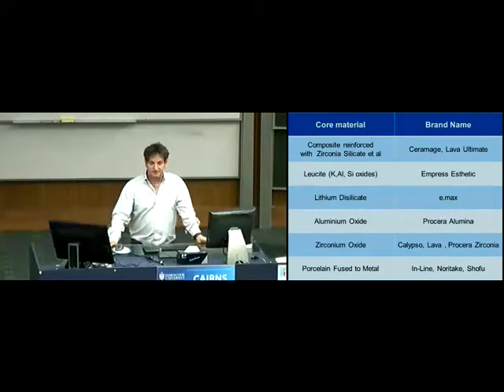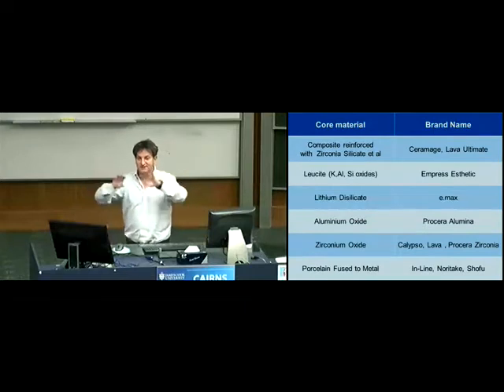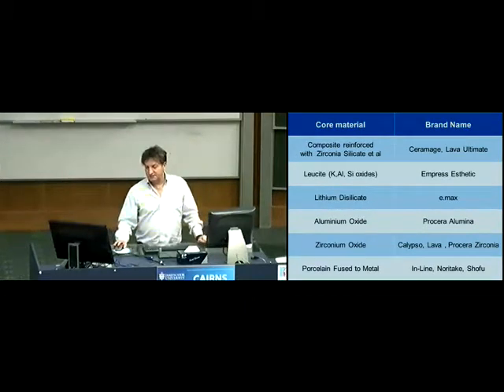And the good old PFMs, around since 1962. Imagine that, we should have a big celebration, the 50th anniversary of PFMs. Still an oldie but a goodie. I'll talk to you a little bit about the metals involved there and where we're heading with that.